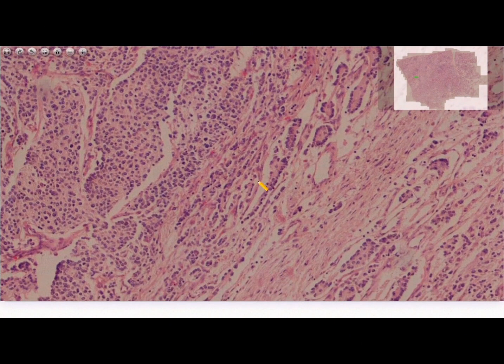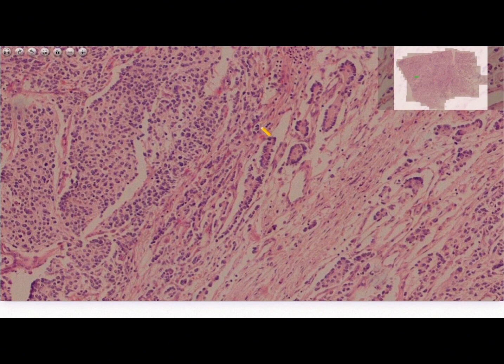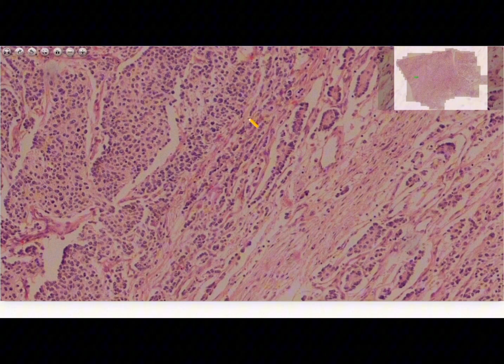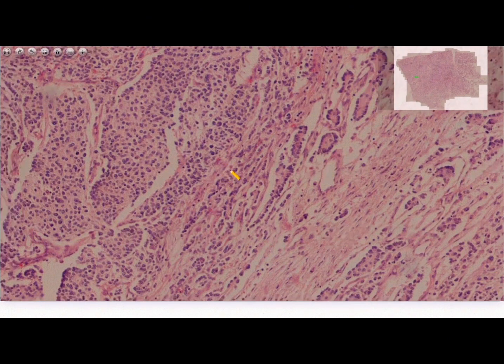But if I want to show you one karyorrhexis in this slide, I can show you this one here. It's a sample of karyorrhexis where the nucleus is broken down into two segments. We also have another karyorrhexis here, where the nucleus is broken down into 1, 2, 3, 4, and 5 small segments here. As I told you, it's a very difficult landmark to find under the microscope, so just keep it in mind for your theory exams that we have karyorrhexis in neuroblastoma.